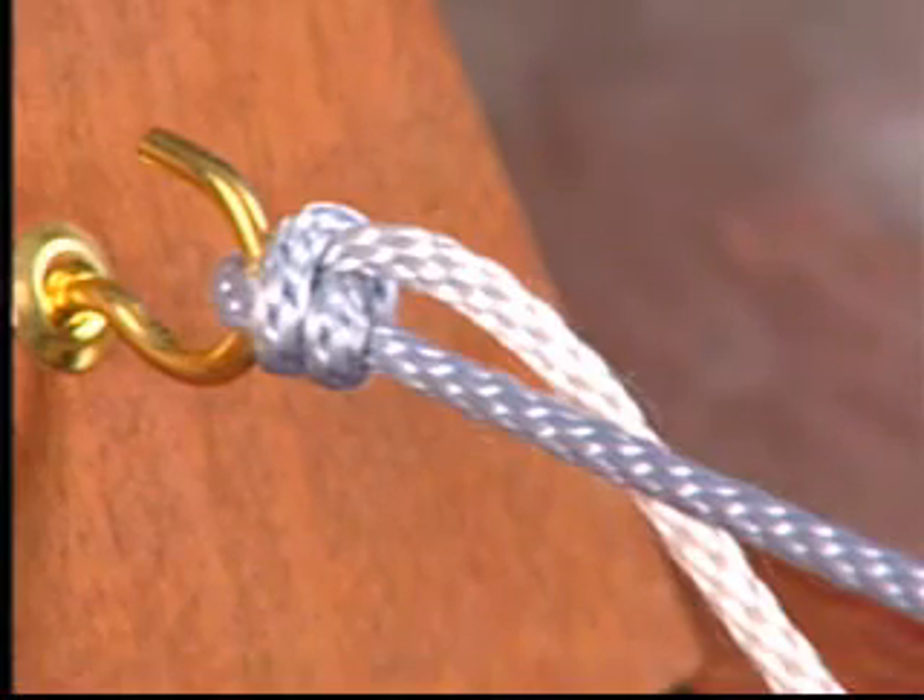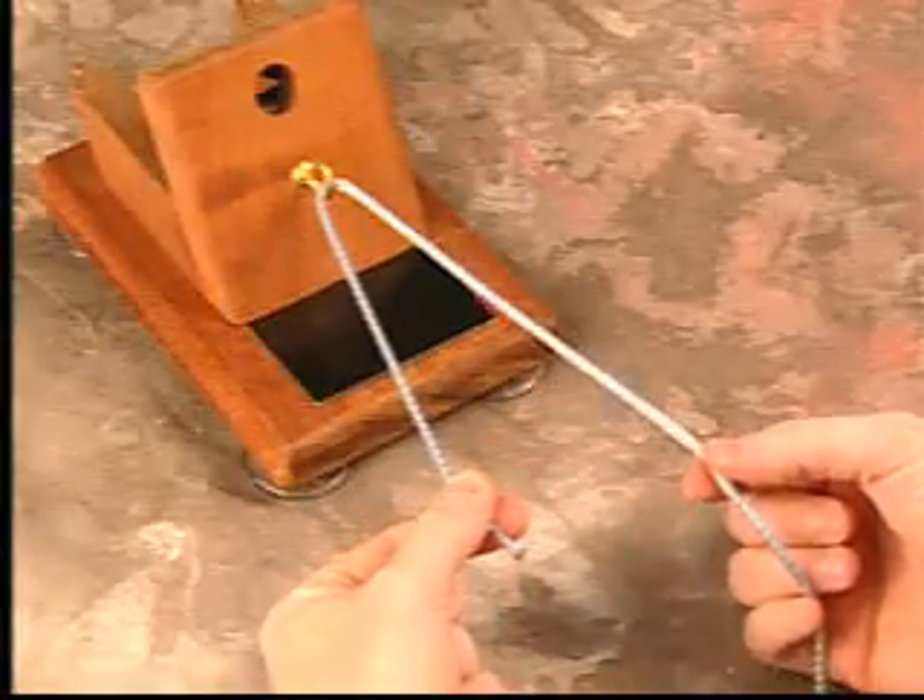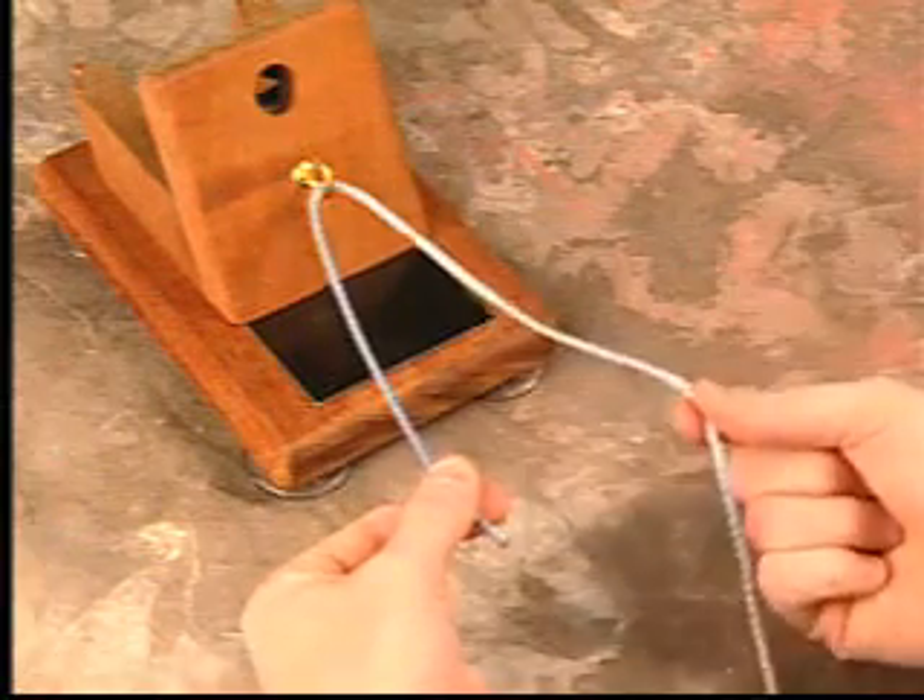This is a demonstration of the Tennessee slider knot. Your post limb is one half the length of the loop limb.